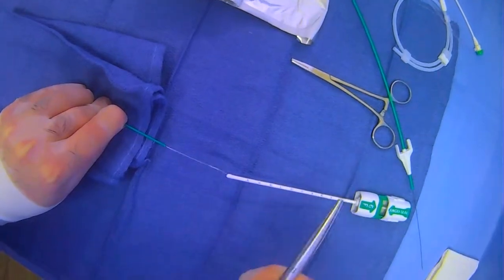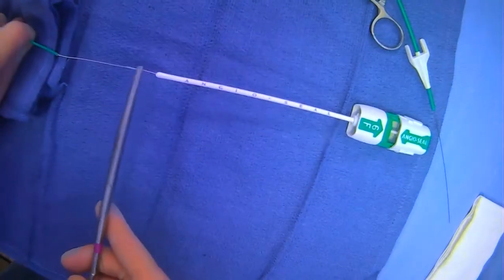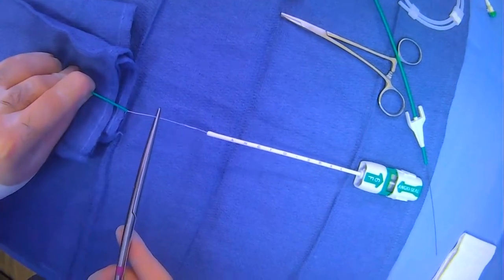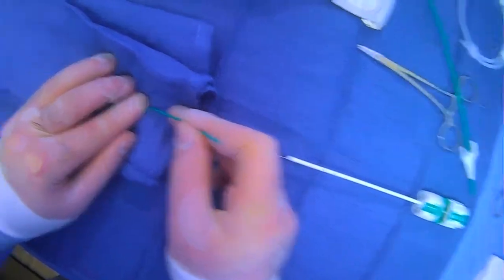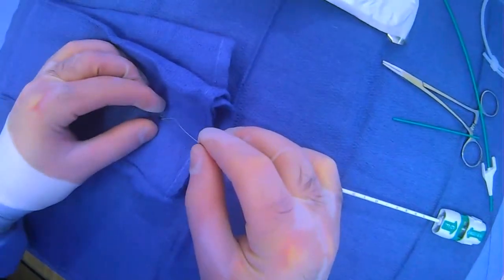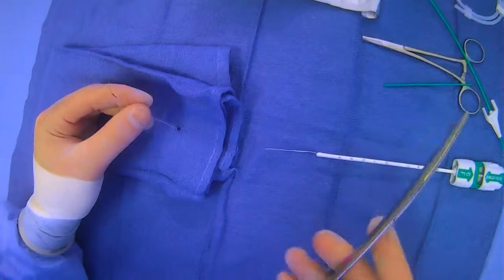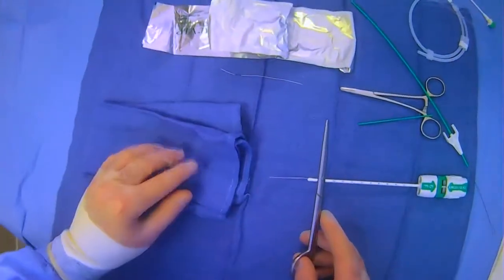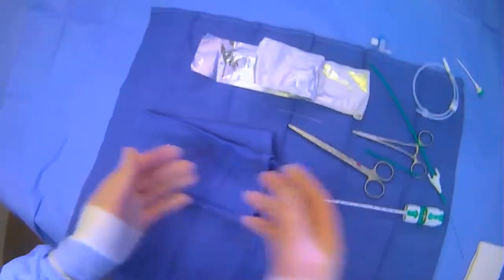We'll take our scissors and cut right above here — between the little clip that prevents the tamping device from coming off and the black line. Then we can pull off our tamping device and we just have a suture left. We make sure we have good hemostasis, then cut the suture flush with the skin. The collagen plug has been deployed and we hopefully have hemostasis — then we can put on a dressing and be done.